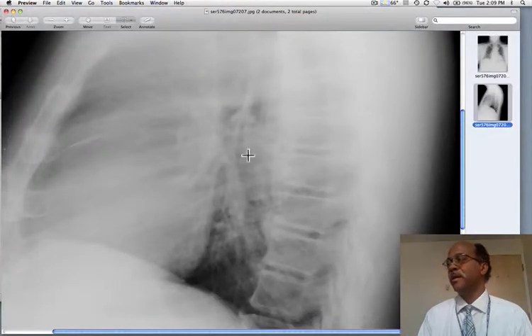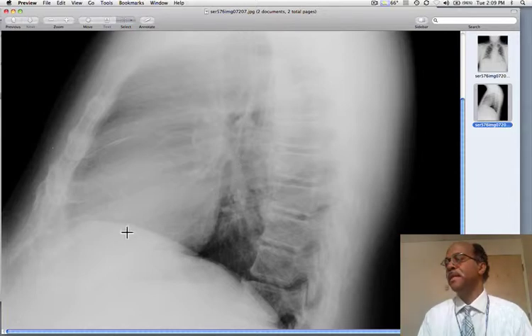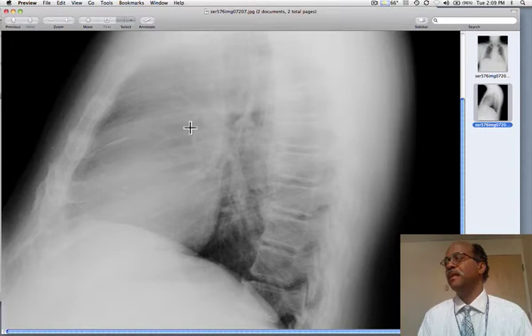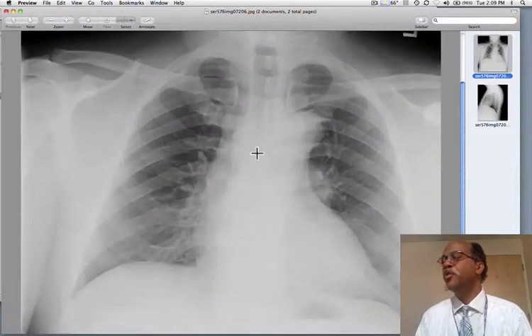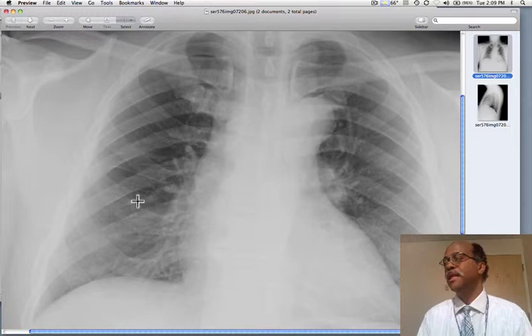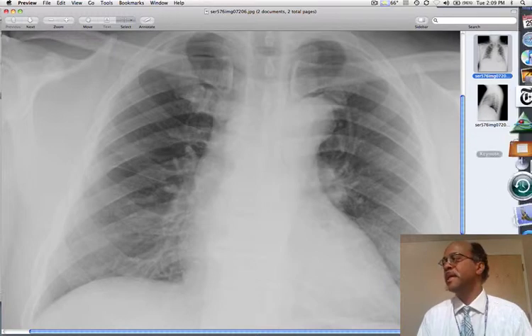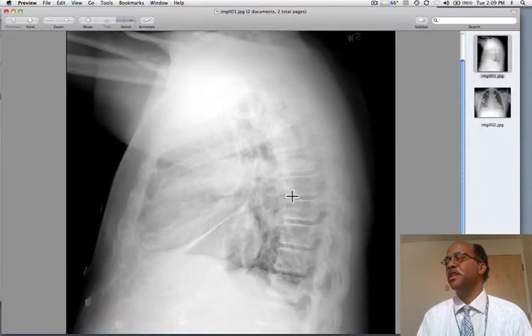If we go back to the original study, here's the lateral projection, and we can see a nice, thin, major fissure. And here we can see the relatively normal minor fissure. So this is a case where a pseudotumor occurs by seeing that there's a loculated collection of fluid in the minor fissure.